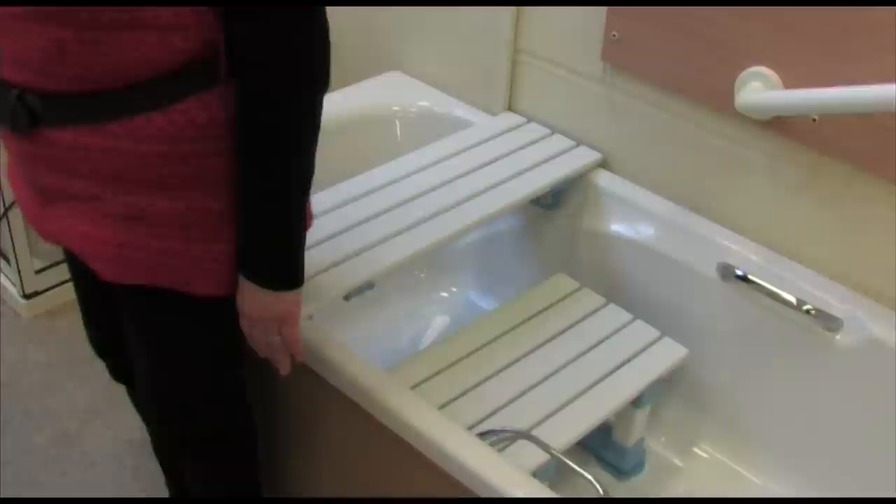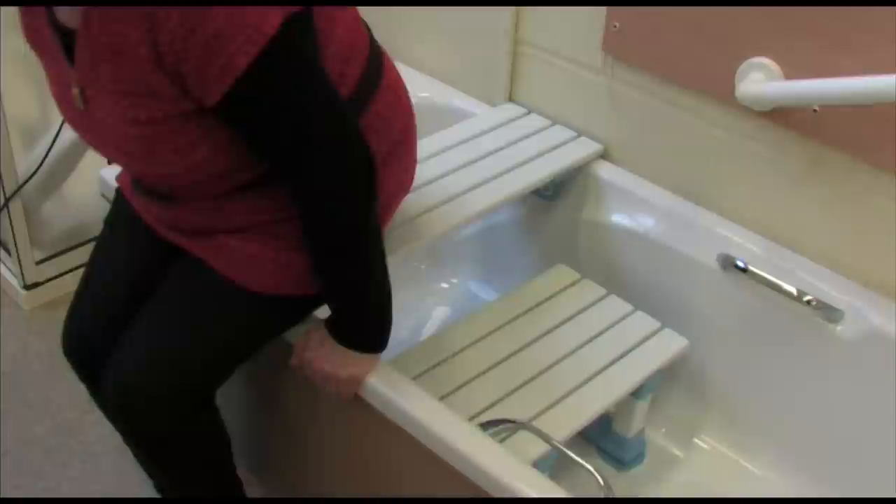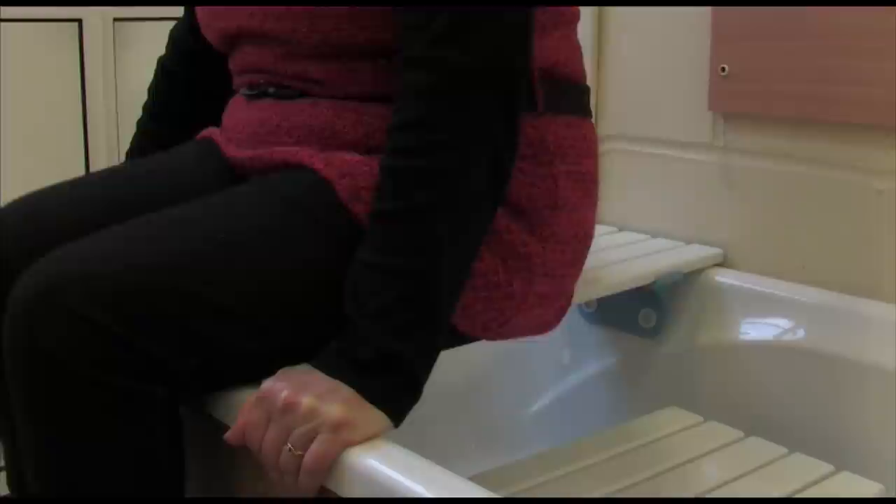Position yourself in line with the board so that when you sit down your bottom will be positioned in the centre of the board. Slowly sit down.